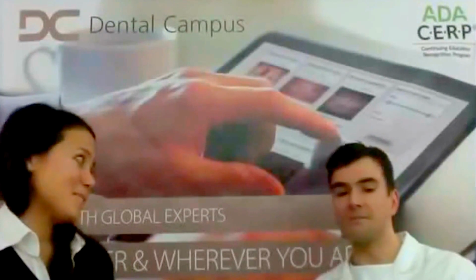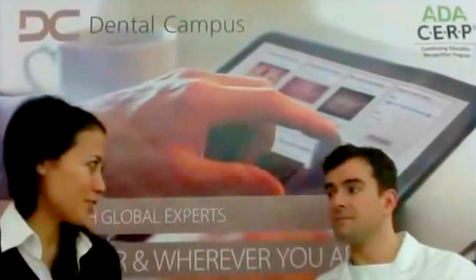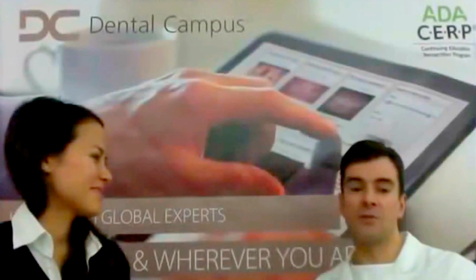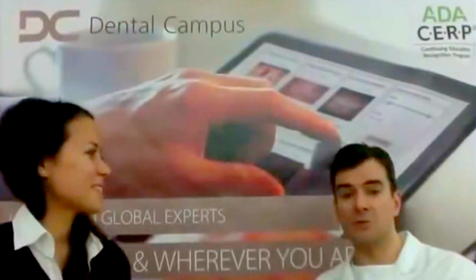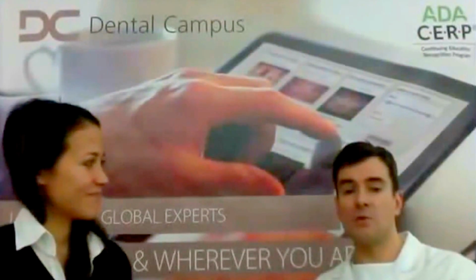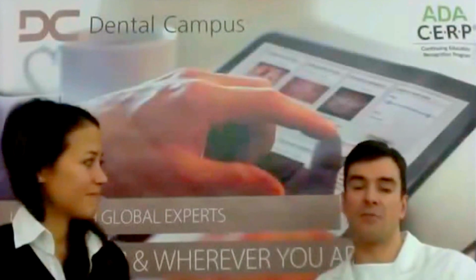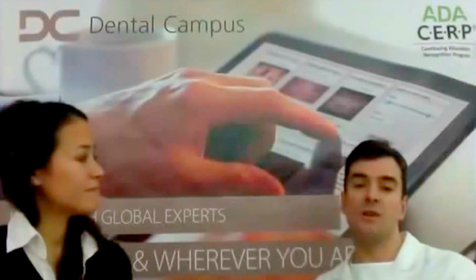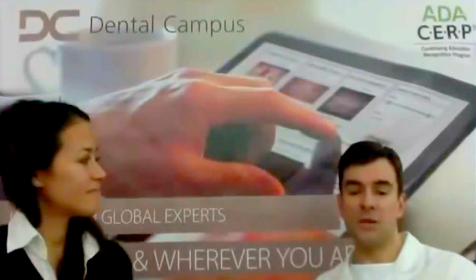And to finalize, my last question: what advice do you generally give a starter in the field of implant dentistry? I think this question goes very well in line with the question about reducing the risk of complications, so it's pretty much the same answer. Try to avoid stress when you do the procedure. Really prepare yourself. And something also very important, for every type of implant treatment, whether simple or difficult, is to start the treatment with the end of the treatment in mind. Of course, we are speaking about backward planning.